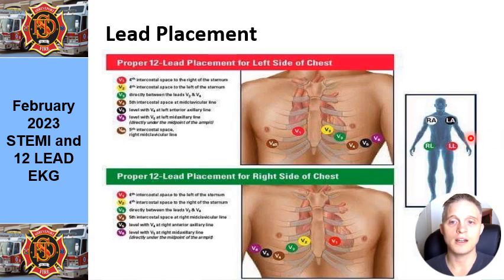And finally, on the right here, we see where we place our limb leads. This is one presentation. You can put it at the chest wall as well as the bilateral lower quadrants of the abdomen. And you can also put it on the distal extremities. Some argue that putting them on the distal extremities, both in the radial area of bilateral arms and the medial malleolar area of bilateral legs, is going to get you a better result. That's neither here nor there. They're non-inferior to one another. But what I will suggest is that you always make sure that you do not put the lead on a bone. It always needs to be on the muscle.